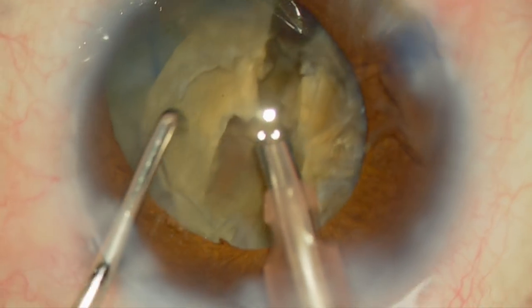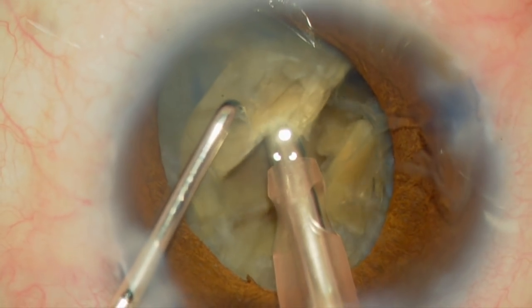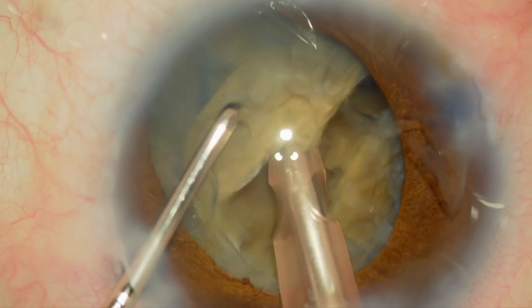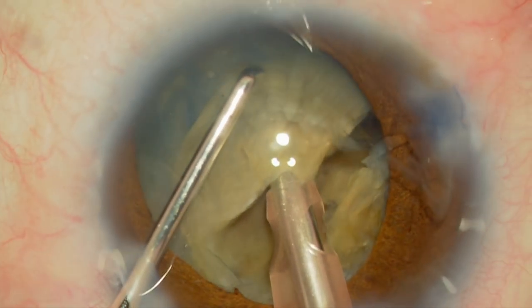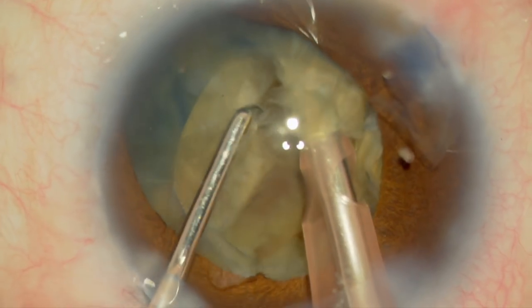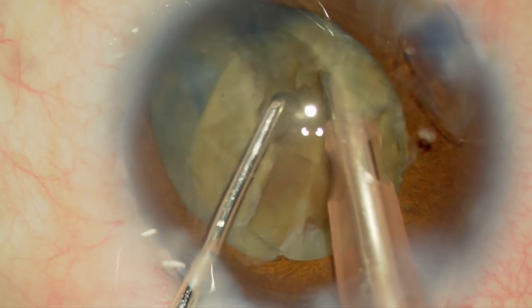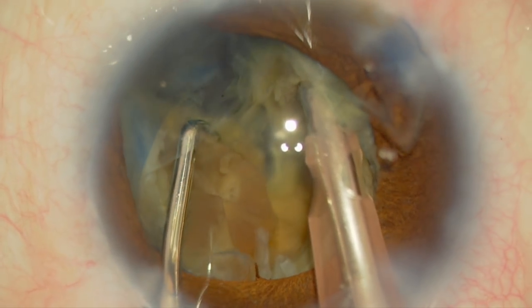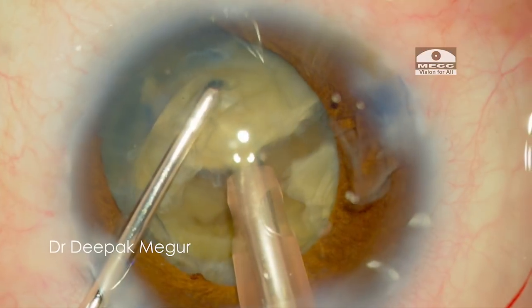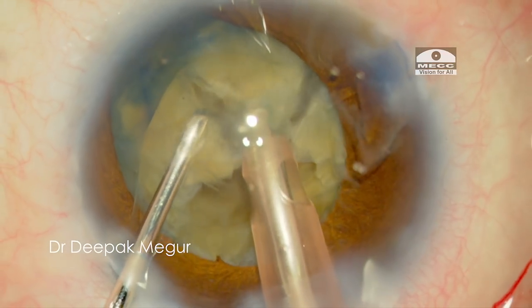The two halves are separated. I proceed to perform subsequent chops in each of the hemi-nucleus. After getting the grip, I score the nucleus by moving the chopper vertically down and then laterally separate at multiple levels, going down subsequently to ensure that the posterior plate is separated. Moving on to the next fragment, I am repeating the same vertical chop with lateral separation.